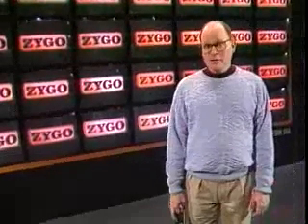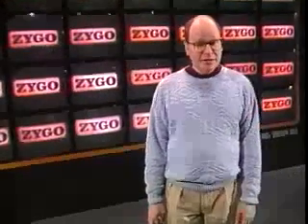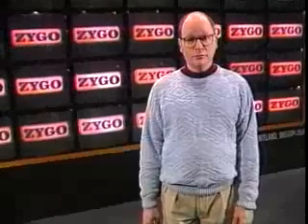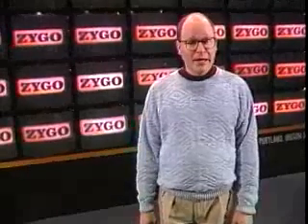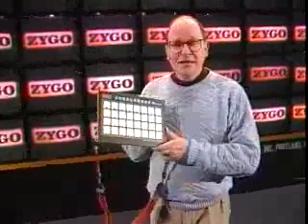I want to talk with you, but cannot speak. What choices do I have? How could I, without assistance, tell you that I wanted to go somewhere, or that I wanted to do something? One way is by using an alternative communication system like this Zygo macaw. In its simplest form, it is a voice recorder that plays back any message that is put in.